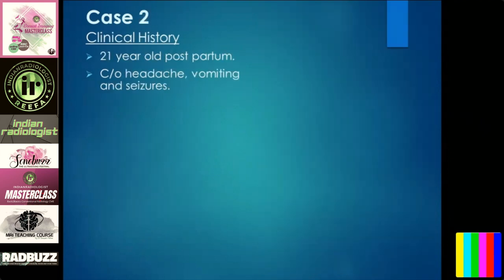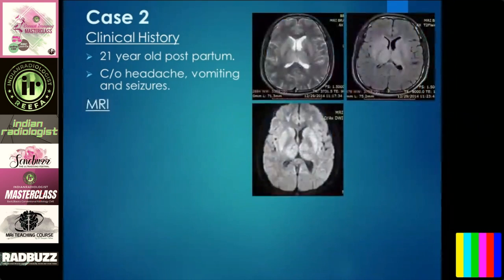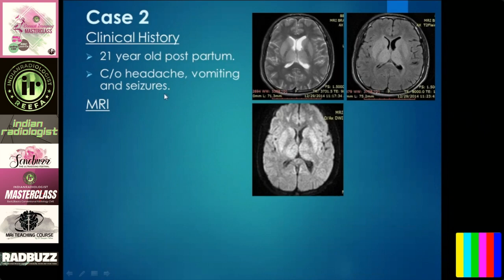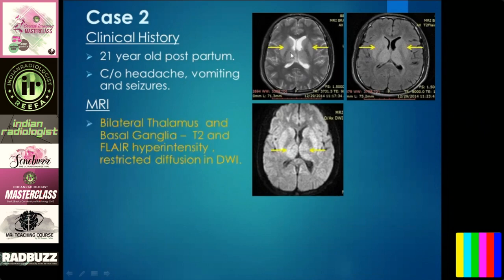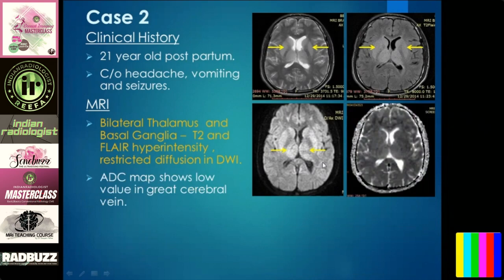Case two: a 21-year-old postpartum patient with complaints of headache, vomiting, and seizures. This is a classical case you will see day in and day out — postpartum lady with these symptoms. On T2 imaging and FLAIR, you see bilateral thalamic and basal ganglia hyperintensities. Diffusion-weighted imaging shows restricted diffusion.